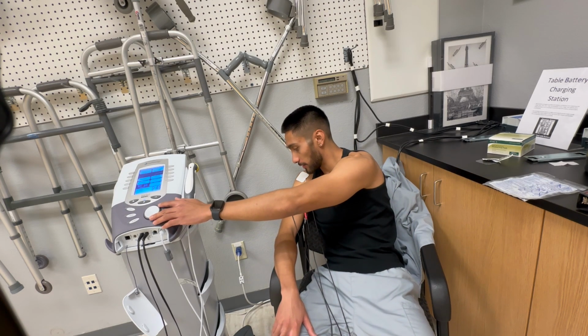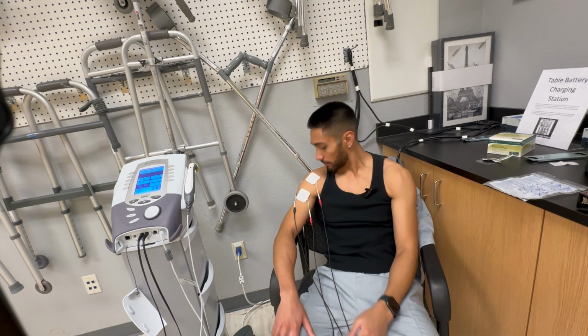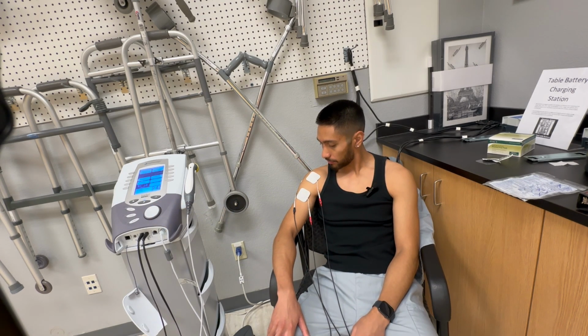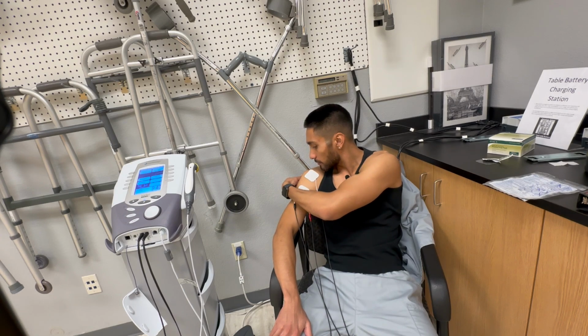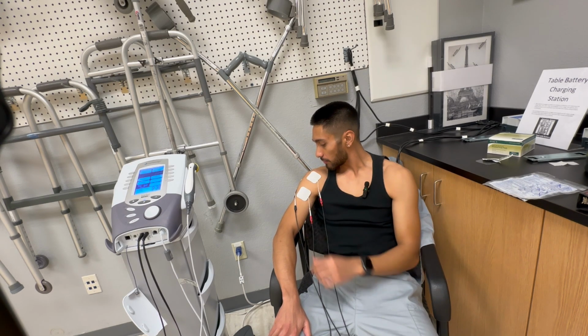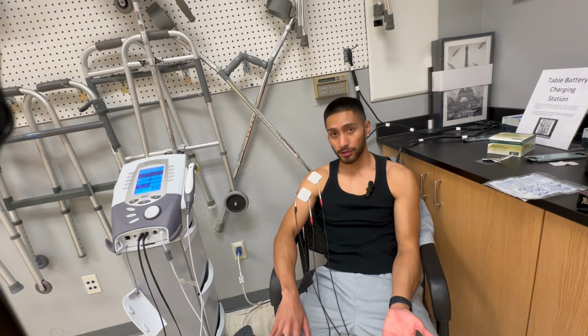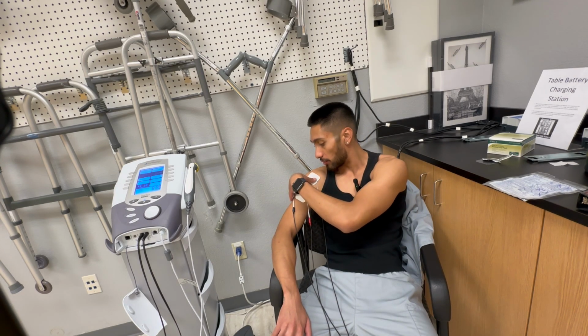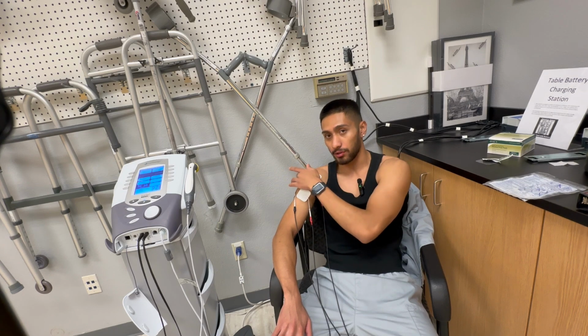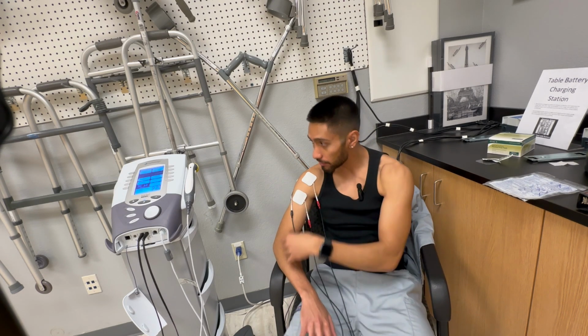Getting a little bit of excess muscle twitching going on, so let's turn that down. For this example, we'll go ahead and switch the vector scan to be off, so rather than the treatment being dispersed, the treatment area will be just centralized into the cross section of the pads.